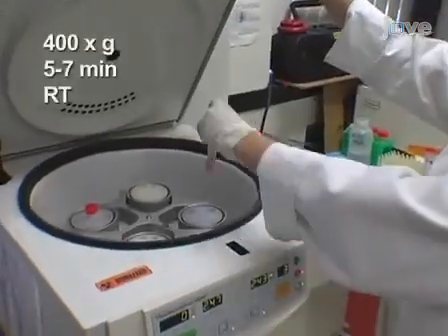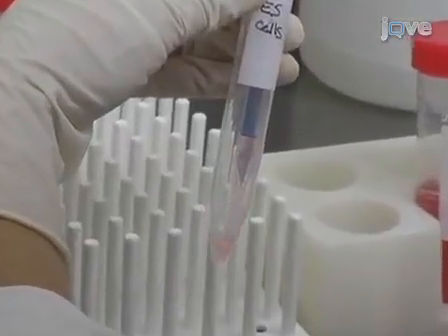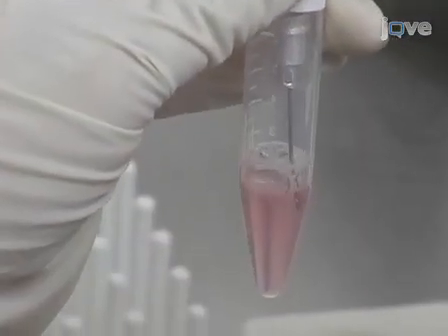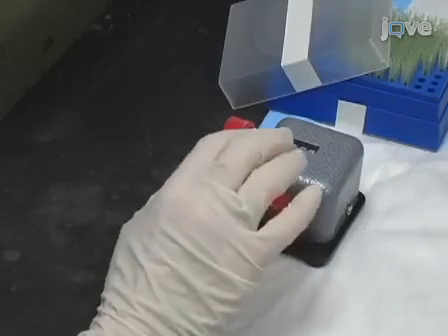Pellet the ES cells at 400 G for 5 to 7 minutes at room temperature. After removing the supernatant, resuspend ES cells in co-culture differentiation media. Use a 21-gauge blunt end needle to obtain a single cell suspension. Count cells using trypan blue and a hemocytometer.